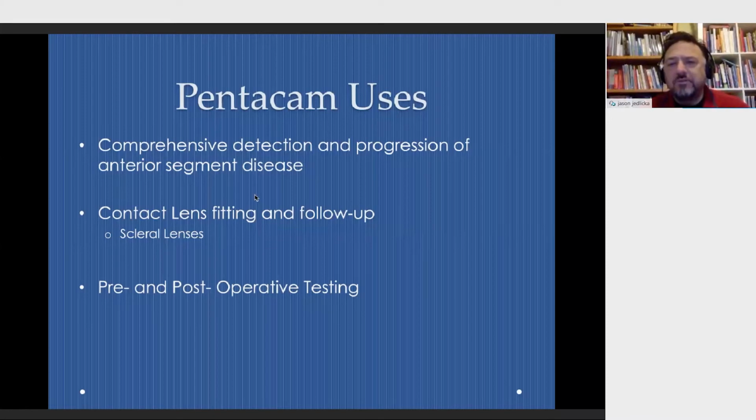And so again, if your interests lie in corneal topography, and if in your practice the vast majority of your patients are regular corneas, I think that a keratograph is a very powerful tool, and will really help your practice.